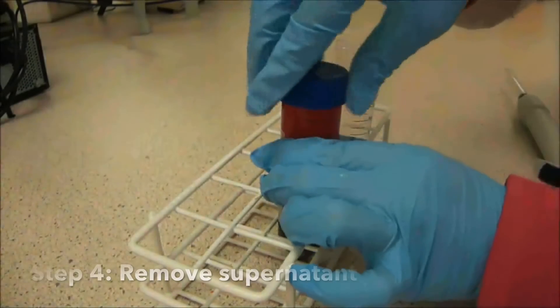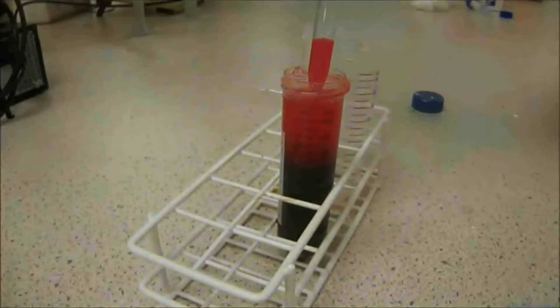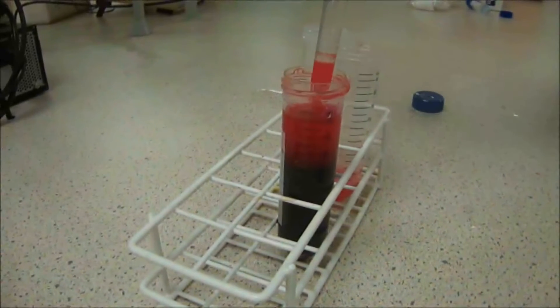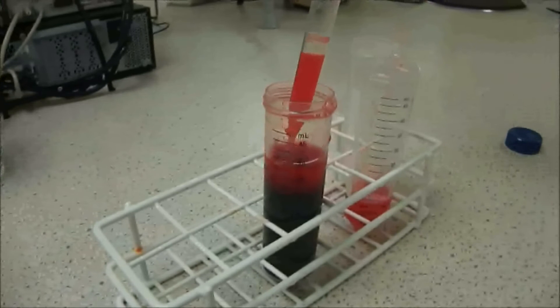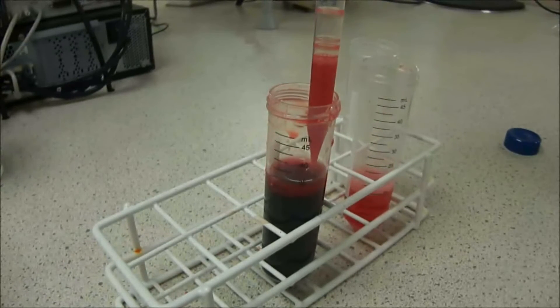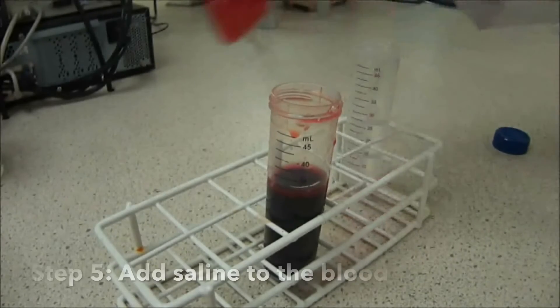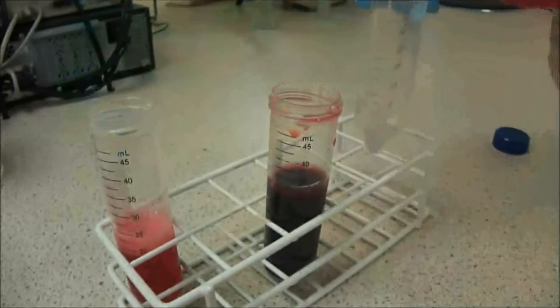Our next step involves washing the red blood cells. Using a pipette, remove the supernatant carefully without disturbing the bottom layer. Once this is done, use a saline solution to replace the supernatant.